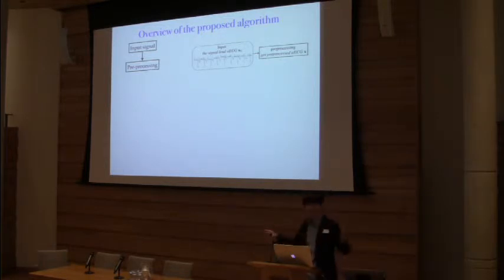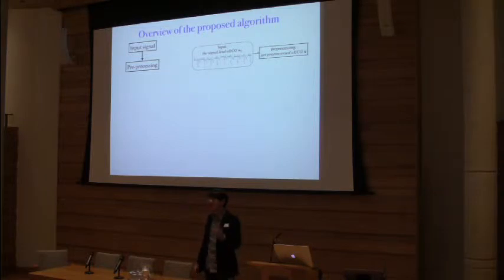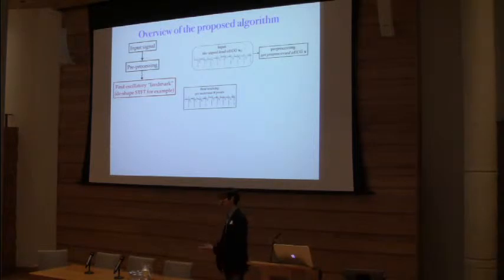Okay, so I will start from the algorithm so that you won't see it again. The algorithm is quite simple. There are only 3 or 4 stages. The first one, everyone knows: you get the ECG signal, you do some pre-processing, remove the baseline, the noise, whatever you want. Here, we just do some kind of bandpass filter to remove the power line and do some detrending. That's it. The second step is you want to determine some kind of landmarks. For example, for the ECG signal, what is the common landmark? R peaks. Very good. So from this ECG signal, we find a way to determine the R peaks. In particular, the maternal R peaks.